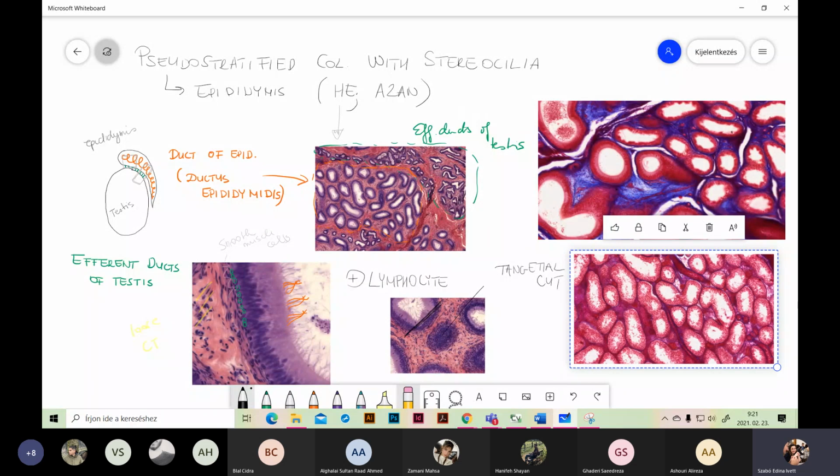Okay. Excuse me, what was that dots that you mentioned? Sorry? Red dots. You mentioned these red dots are the place that the immature sperms are located. What is the name? There are several immature phases, and they have several names. Spermatogonia, primary spermatocyte, secondary spermatocyte, but in this semester you don't have to know these names. Immature. So just you need to say immature. Yes, absolutely enough.